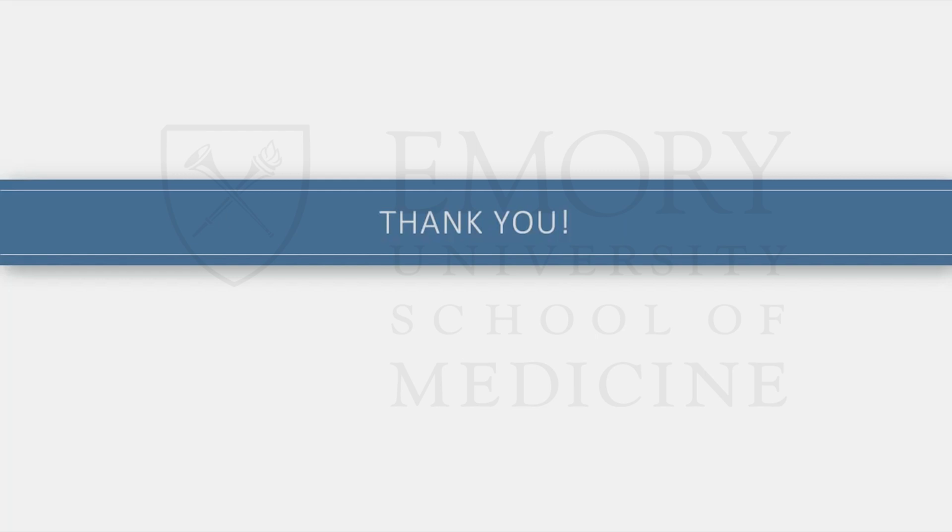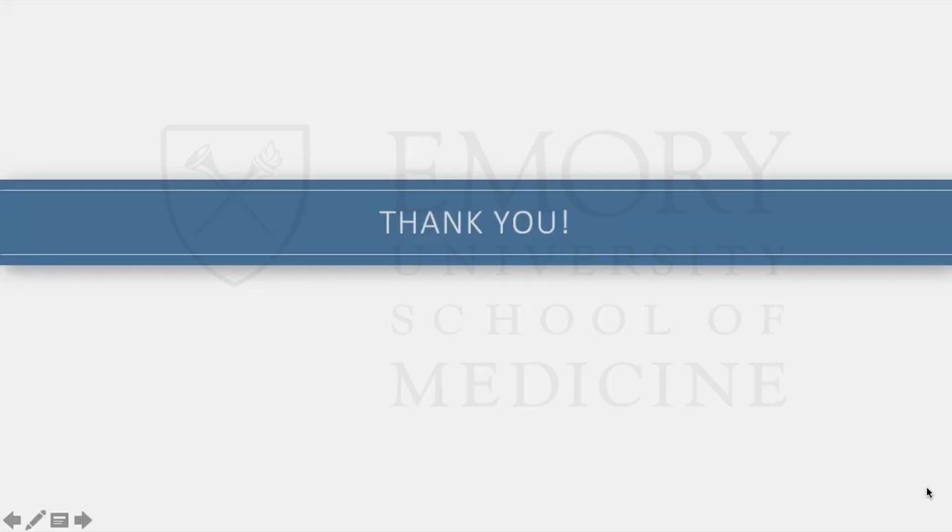This is Neil Dickert. This is a really great talk, and it nicely highlights the fact that there are so many measures that it's hard for us to know what to do with. One thing that I think is really important, and this is a tag on to the last comment about the E to A ratio, is that these are a series of branch points in so many ways, and you have to really watch what you choose as your first branch point. Right. So just as Robbie mentioned, if you start with the E to A, you're immediately going to go down the track of starting with an assumption that many people have abnormal diastolic function, and that's going to be wrong.